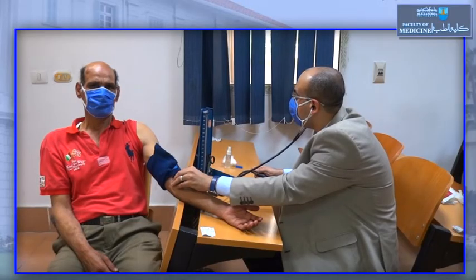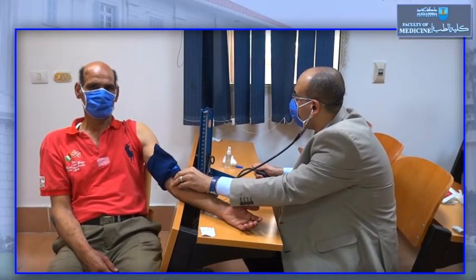And then we decrease the pressure slowly, 2 to 3 millimeters of mercury each second. And we hear the sound.